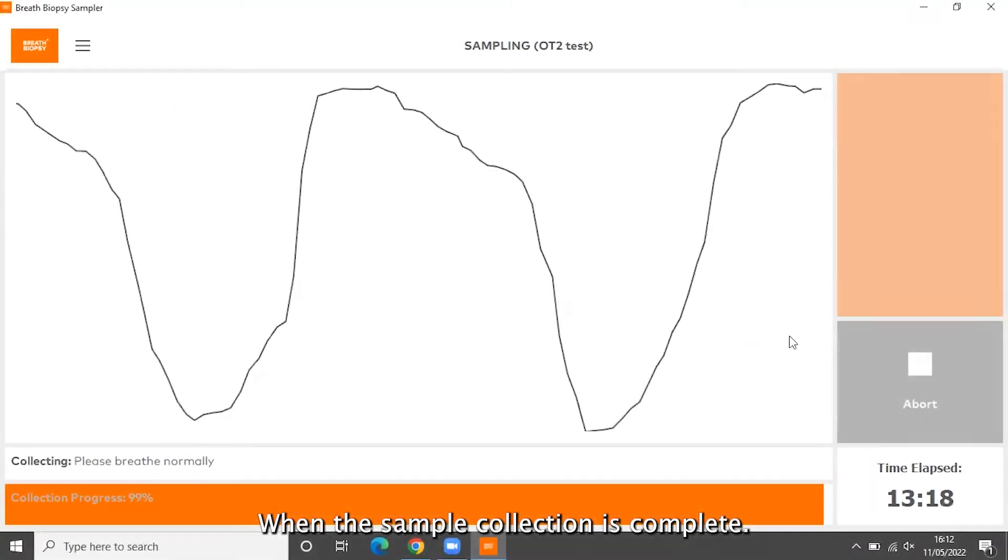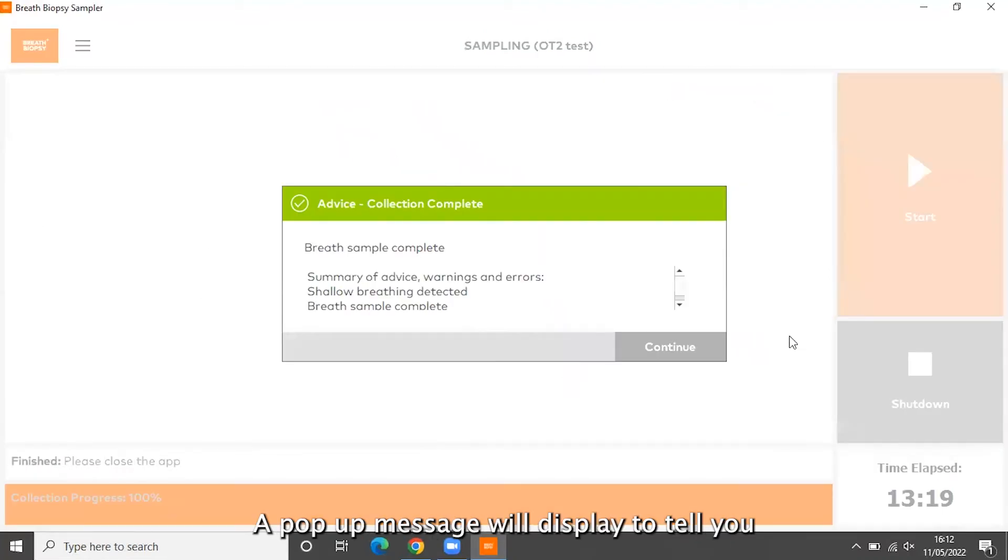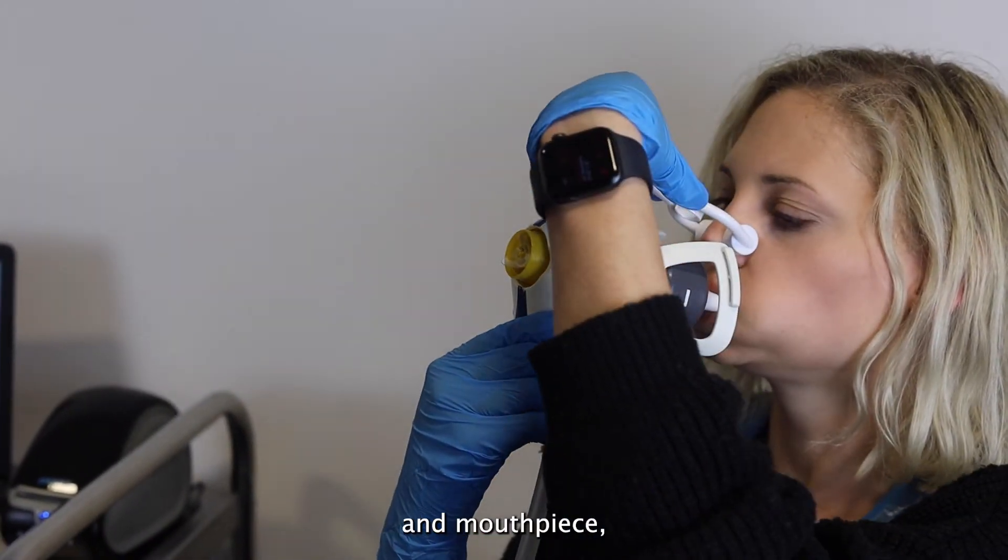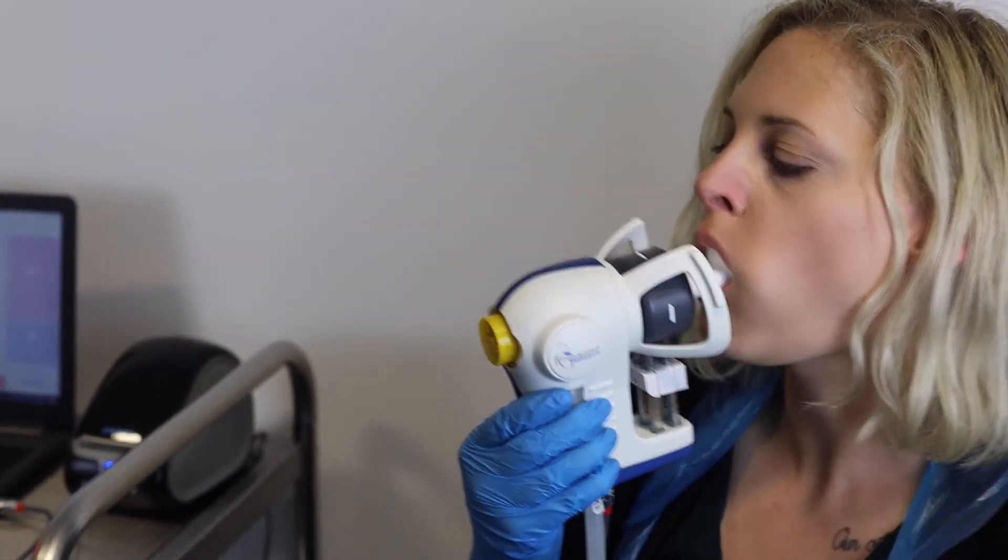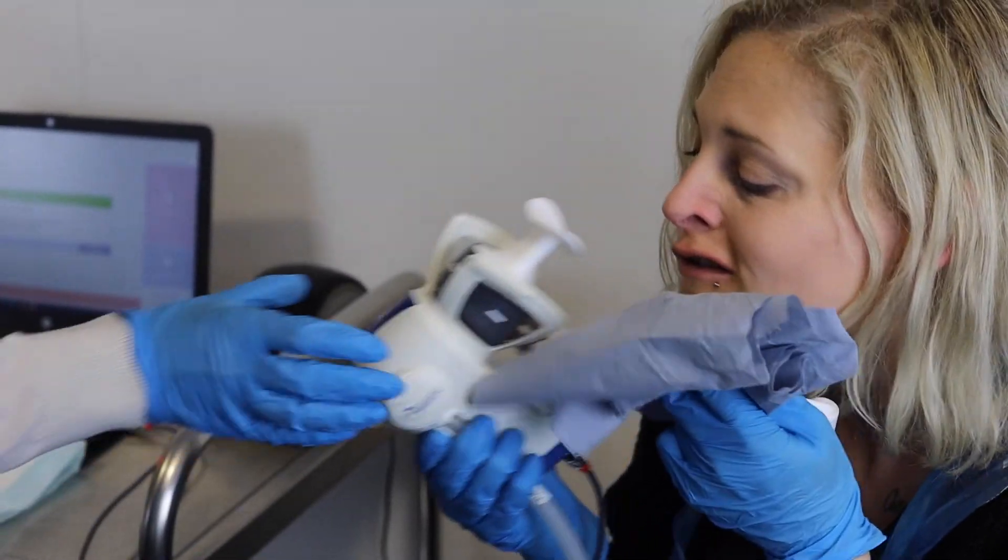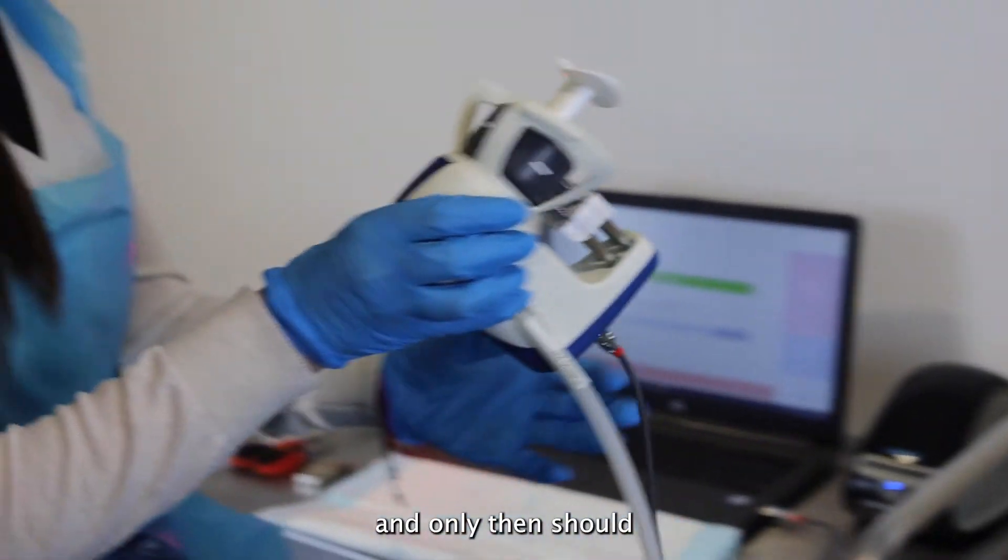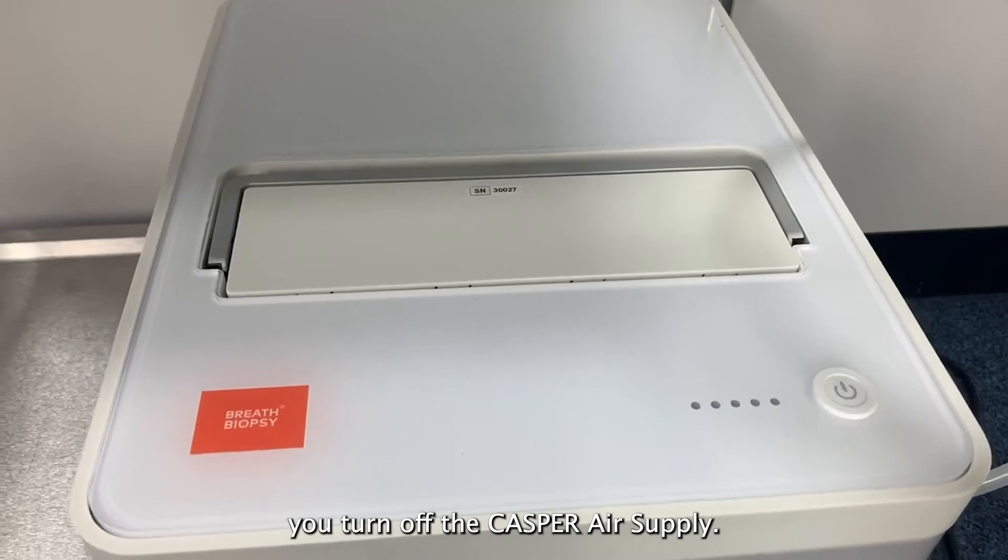When the sample collection is complete, a pop-up message will display to tell you sampling has ended. The subject should remove the nose clip and mouthpiece and only then should you turn off the Casper air supply.